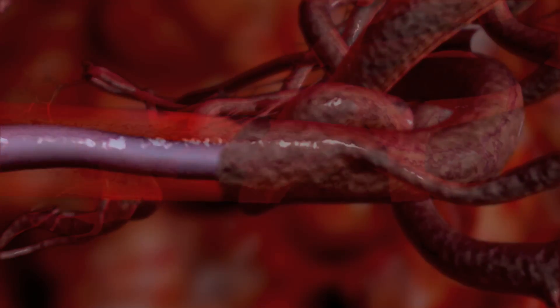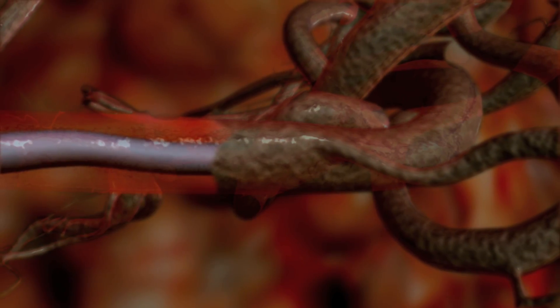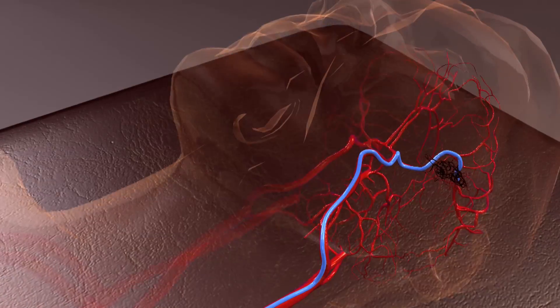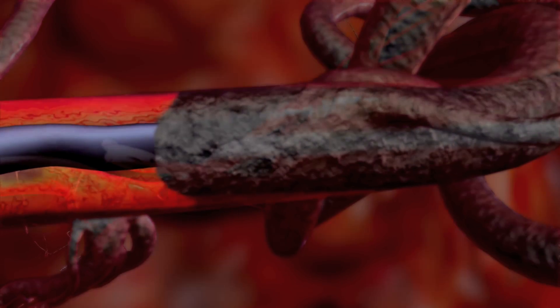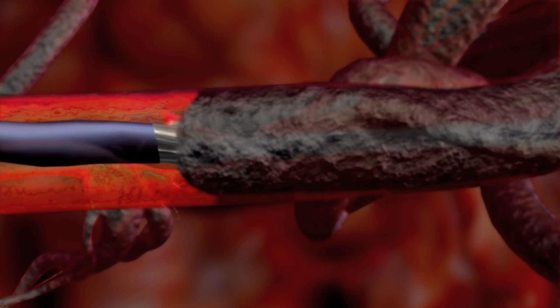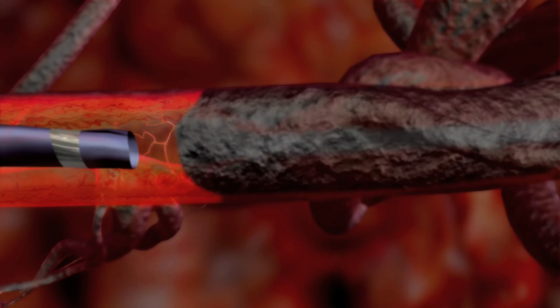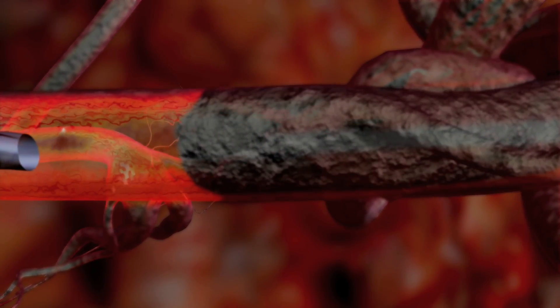Stop the injection if Onyx is not visualized exiting the catheter tip or if increased resistance is observed. Once a predetermined amount of the nidus has been embolized, aspirate the syringe by 0.1 milliliters. Slowly remove the slack from the microcatheter and maintain gentle traction. Onyx is cohesive, not adhesive, so the microcatheter should slowly slide out of the Onyx cast. Once the catheter is free of the cast, it can be removed from the vasculature. In the event of difficulty removing the catheter, refer to the instructions for use.